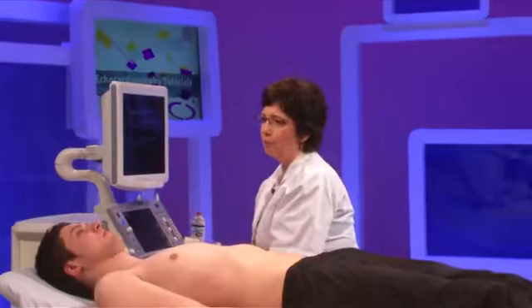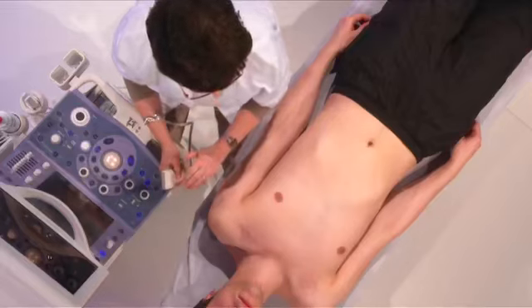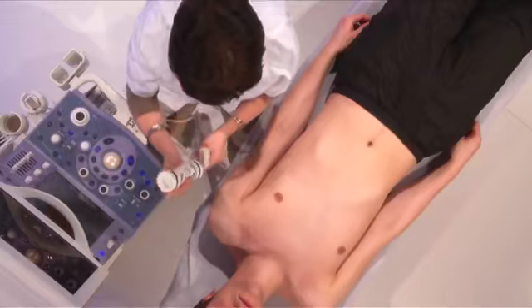Today I'm going to show you how to perform a carotid examination with echo Doppler, and especially to show you how to assess the severity of the carotid stenosis. A very important thing, of course, before beginning is your position. You can stand at the head of your patient, but if you're a cardiologist, you will probably prefer to sit at his side, on the left side or the right side, as you prefer. So we're going to begin.